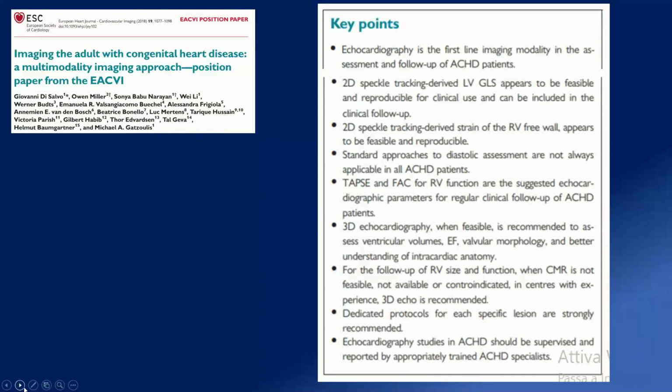I would say that echocardiography is the core of the diagnostic evaluation of ACHD patients. But as you can see from this table, it's not only general echocardiography that is recommended, it's also the application of advanced echo modalities like speckle tracking or 3D echocardiography.